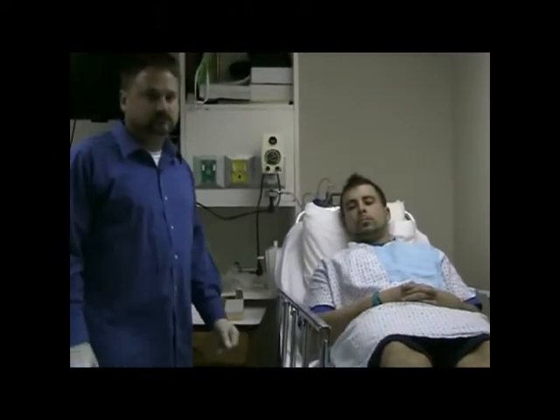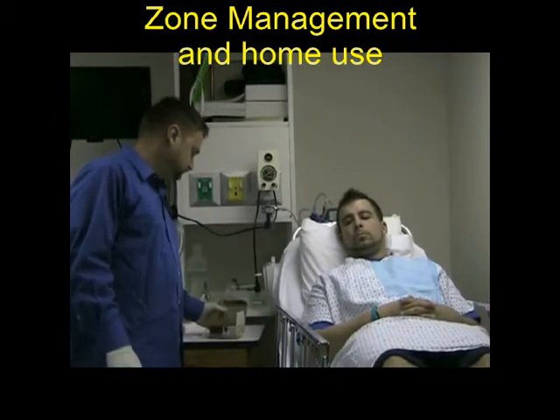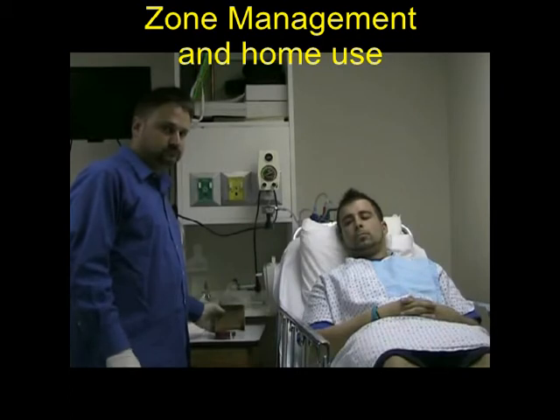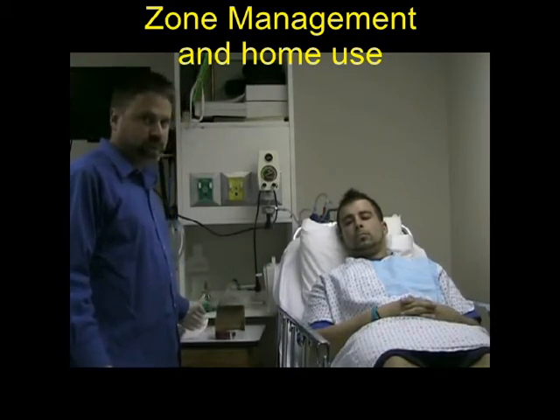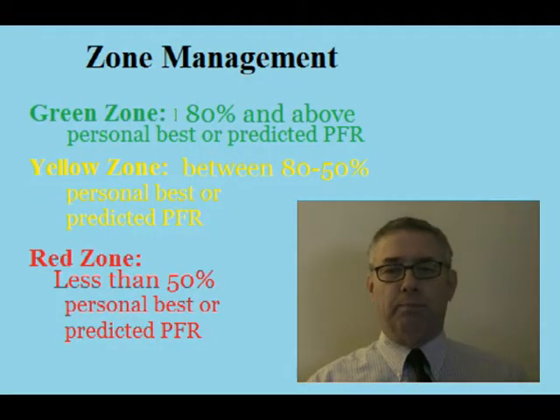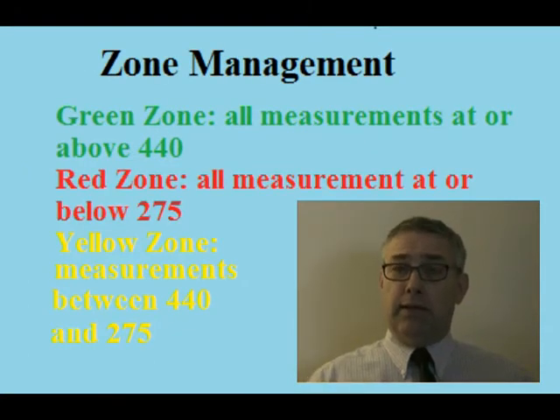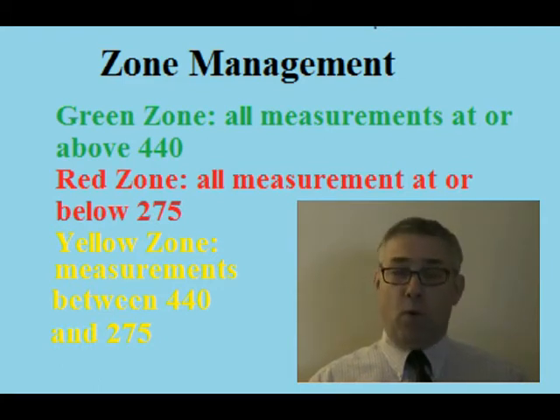If this peak flow meter is for home use, instruct the patient on the zone ranges as well as care and use. The peak flow meter has a little indicator. When setting the green zone measurement, we're going to look at the zones: green zone is 80% and above, red zone is 50% and below, and in between the two is the yellow zone.